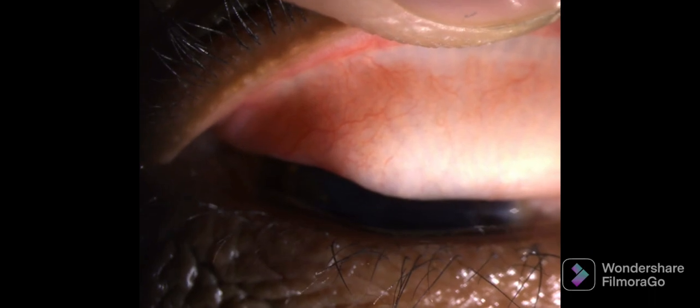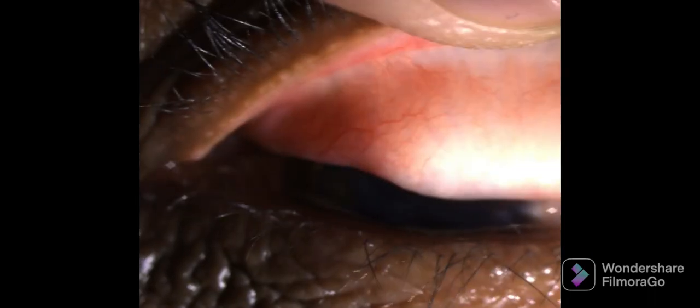The fourth structure to be examined is the lid margin, which is examined for the opening of the Meibomian gland. As you can see in the video, the small circular white opening shows the Meibomian gland opening in the lid. Now it is more appreciable. The next structure to be examined is the tarsal conjunctiva.